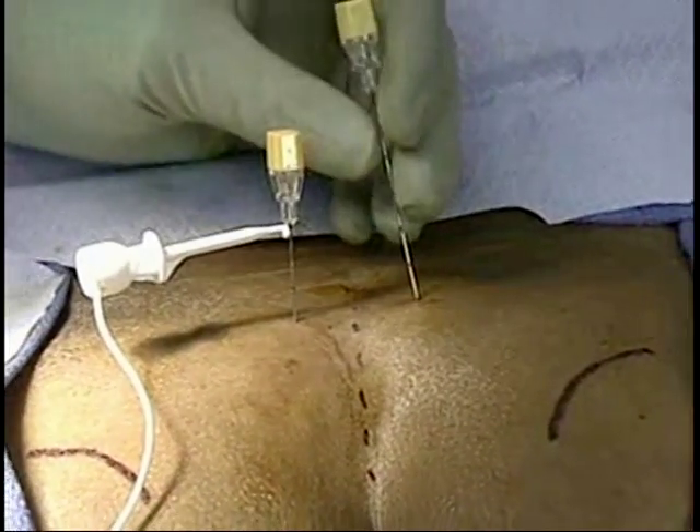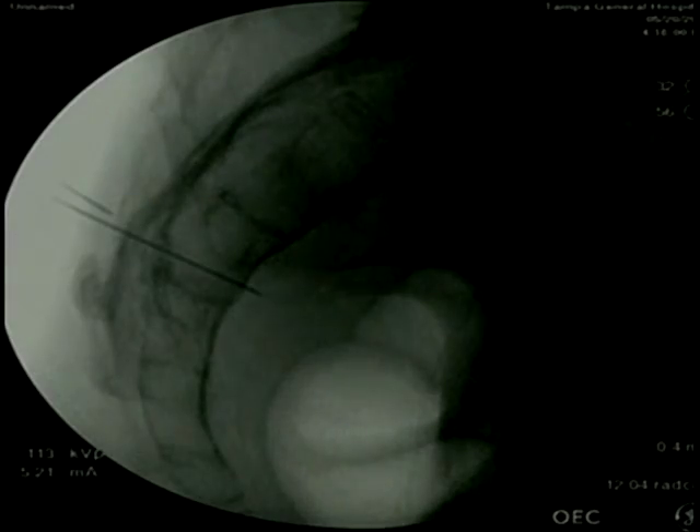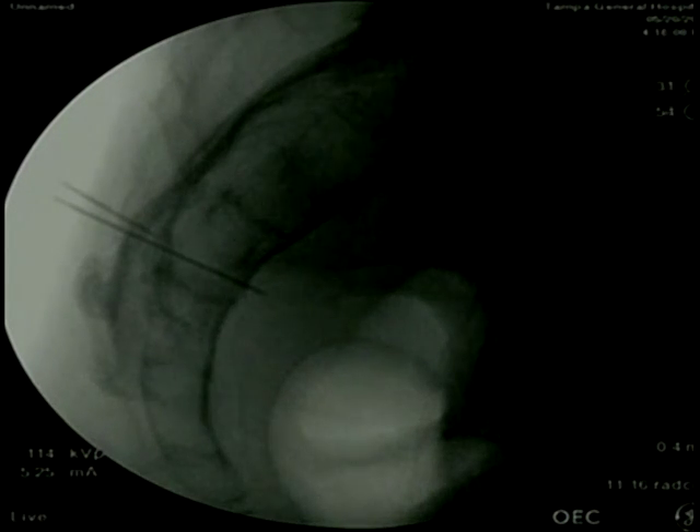Right now we're using fluoroscopy again. We're seeing him trying to get into the foramen as we talked about before — trying to find that most medial upper part of that S3 foramen to get the best signal. The key is it's a fairly large foramen, and you want to get closest to the nerve so you use the least amount of energy to get the best stimulation.